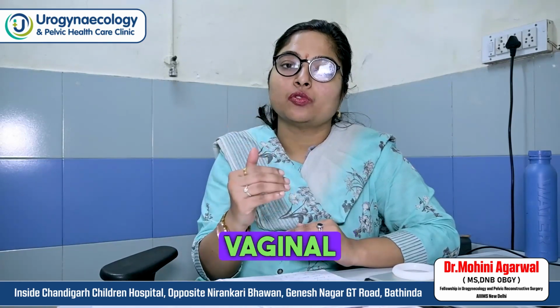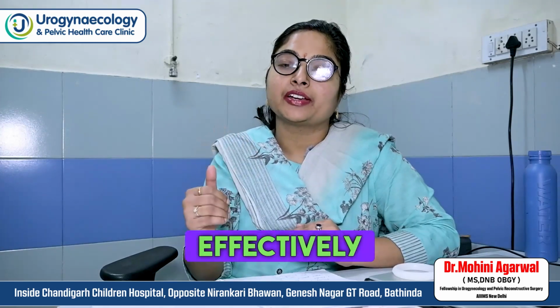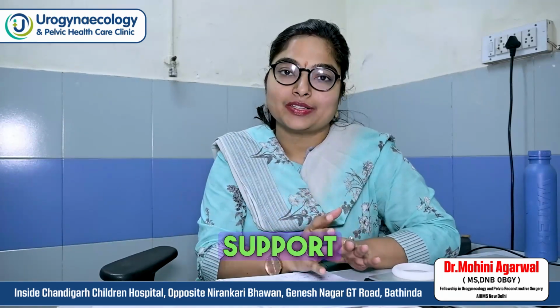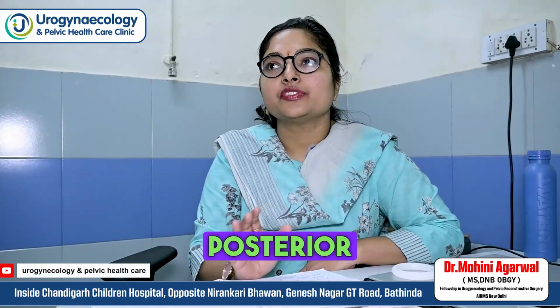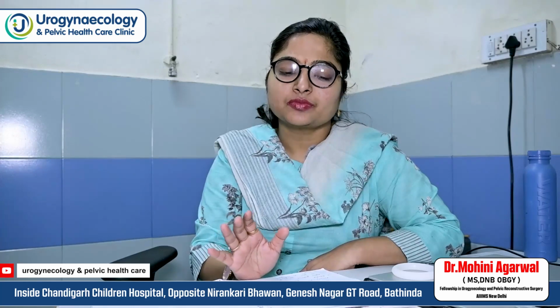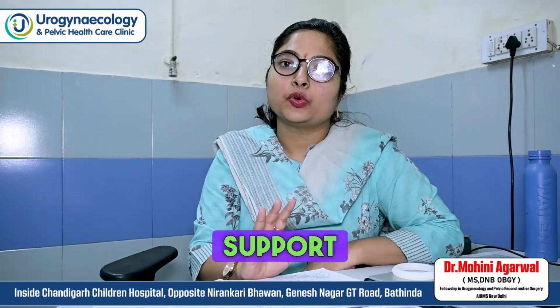So posterior vaginal wall prolapse will not be effectively treated with the help of support pessary, ring pessaries. Okay, so ring pessaries are not used for the posterior vaginal wall prolapse. So these are the support pessaries.